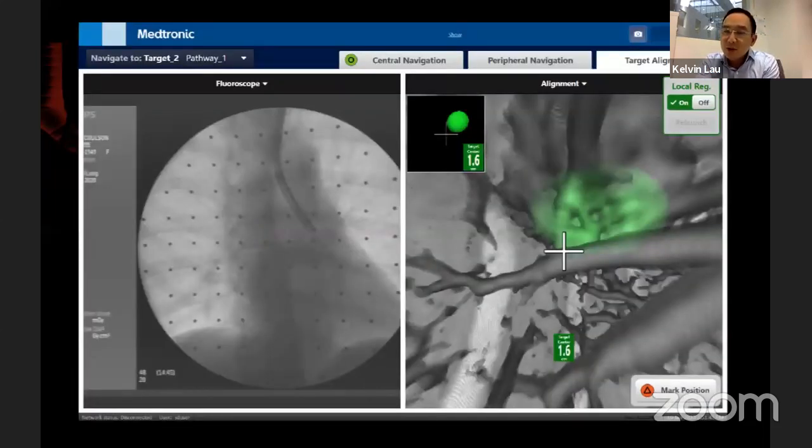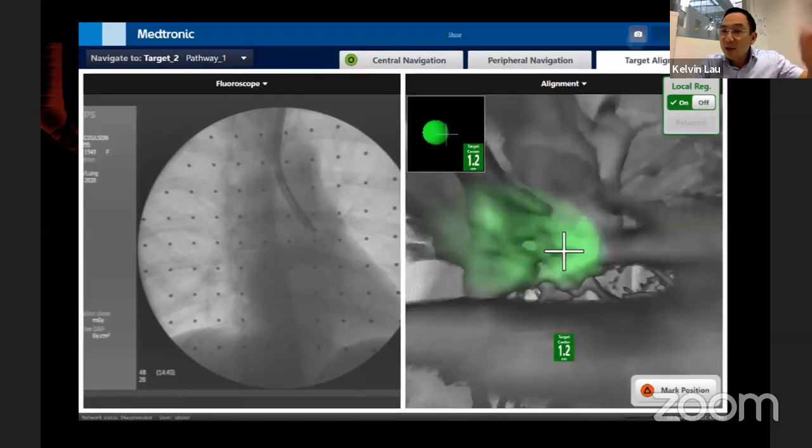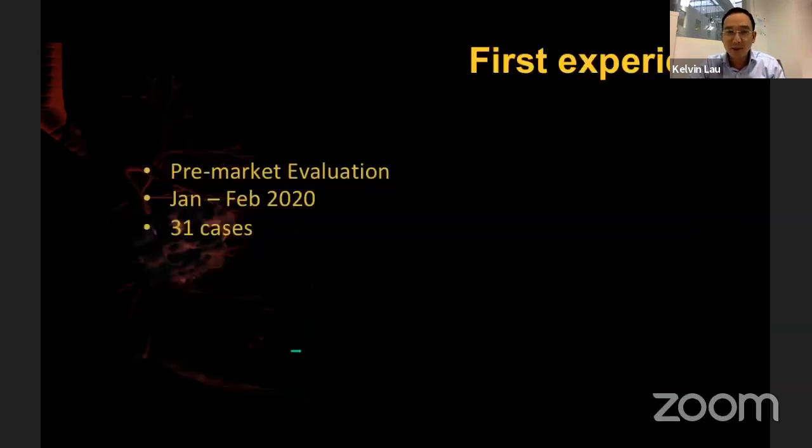Equally, the other thing you can do here, you can see that when you're aligned, actually you need to readjust your position, or you want to sample different areas of the tumor in case part of it you miss. So you can sample a bit here, and then you can rotate it, and in real time you can check where your biopsy position is and then change and have multi-site sampling.